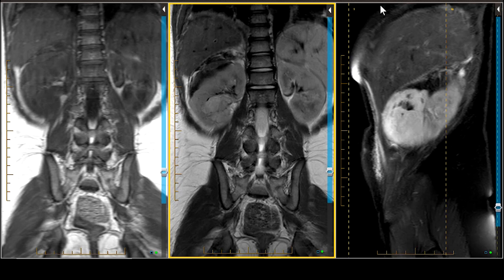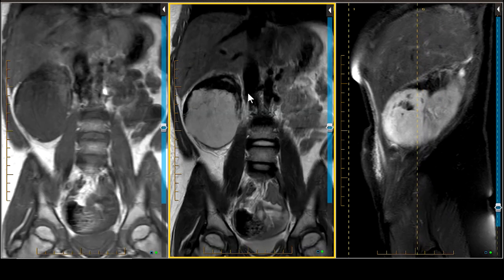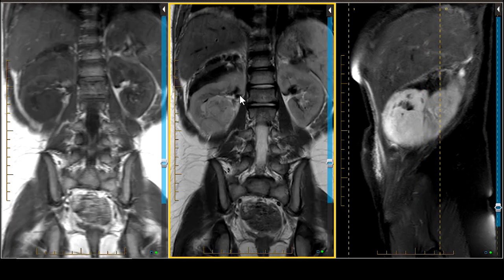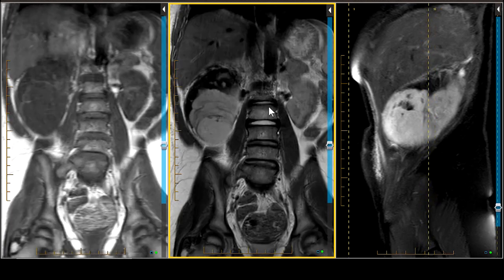Along with the claw sign, identify the adrenal glands in axial and coronal projections. Features that would push you toward neuroblastoma rather than Wilms tumor include calcification: about 85% of neuroblastomas calcify on CT versus about 15% of Wilms tumor cases. Tumor encasement of vessels occurs in neuroblastoma, versus displacement or invasion with Wilms tumor. Looking for the renal vein, we can see it is displaced but not invaded and not encased, which favors the diagnosis of Wilms tumor.